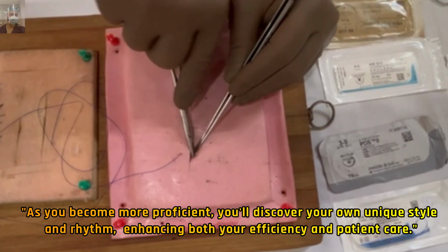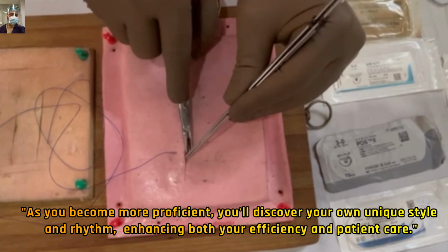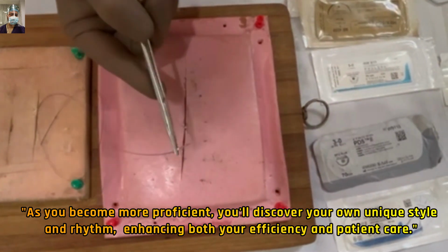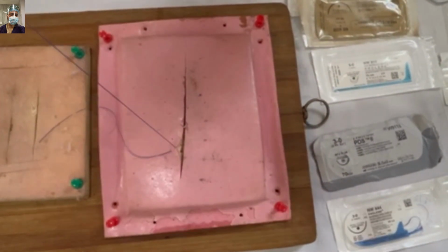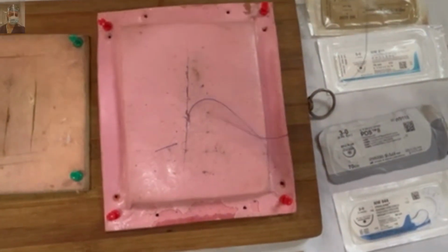Again, roughly 1 to 1.5 centimeters from the margin, and you have to stay on the same horizontal plane. Don't create different entry and exit points.